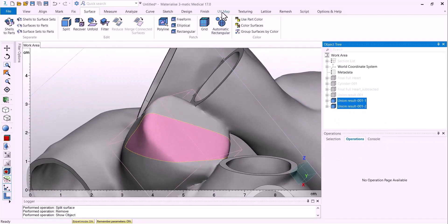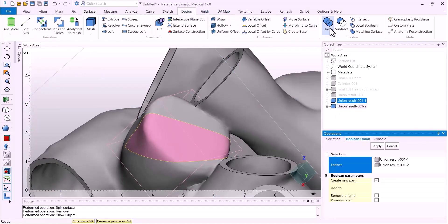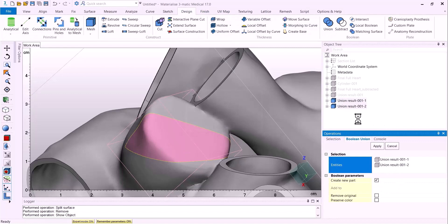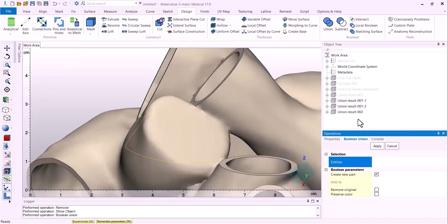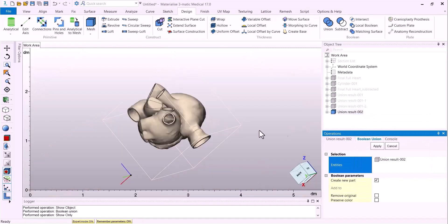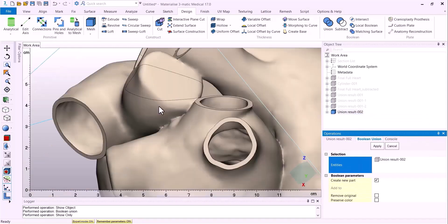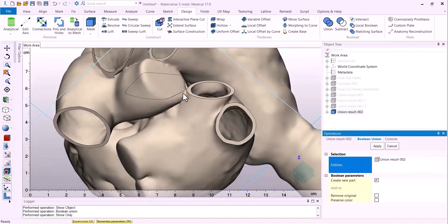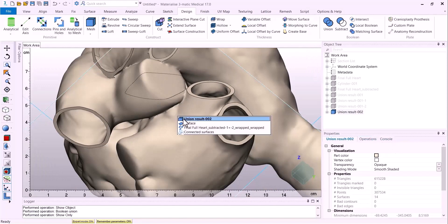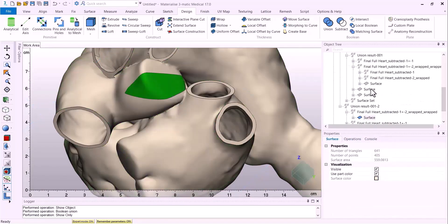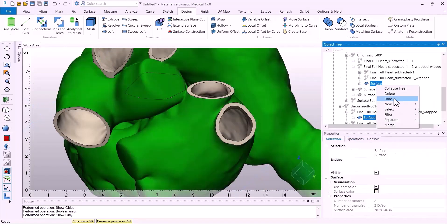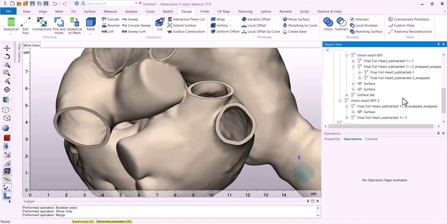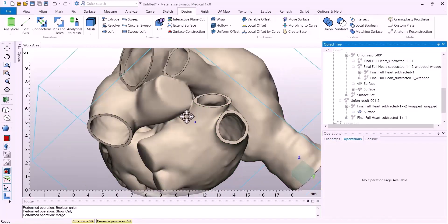So here we will boolean union these two pieces back together, and we will see a final model with the trim performed. Of course, we can always merge these two surfaces together if it looks better that way for you.